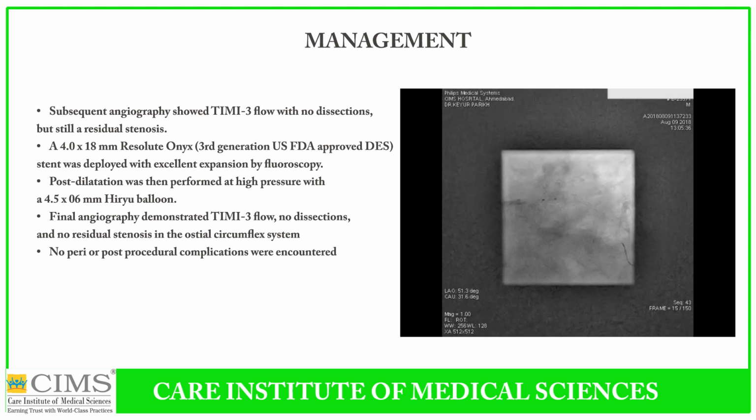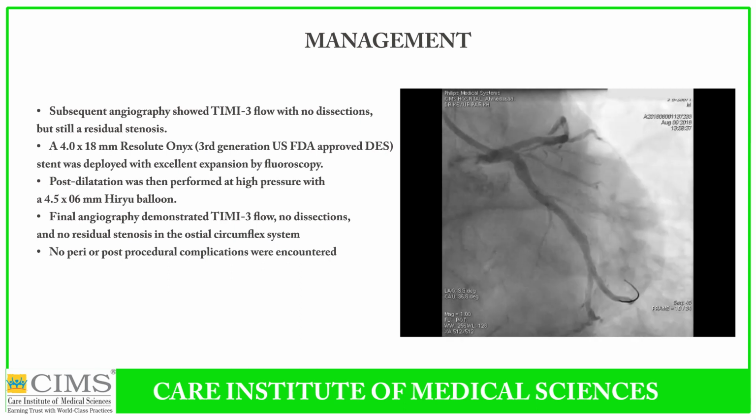Post dilatation was done across left main and ostium of the circumflex. Stent was placed across from circumflex into the LAD.